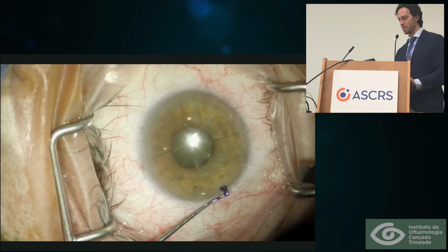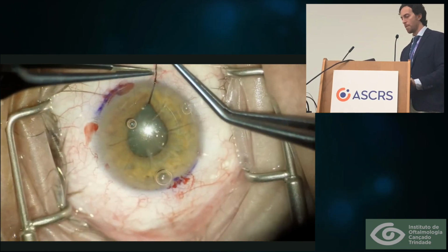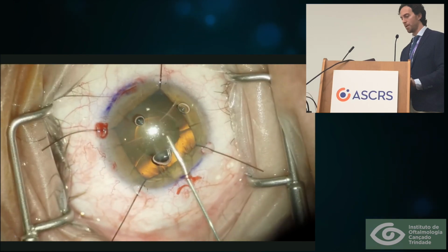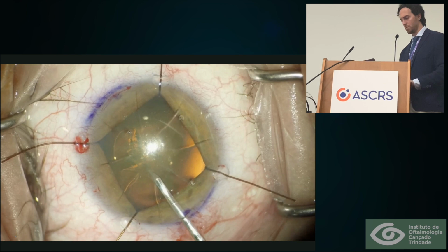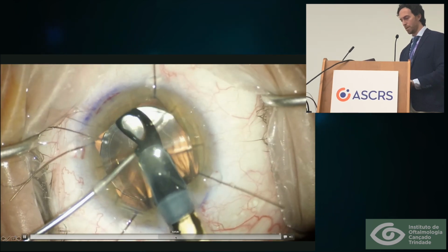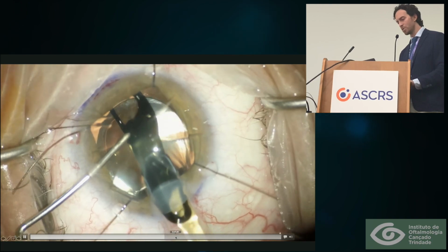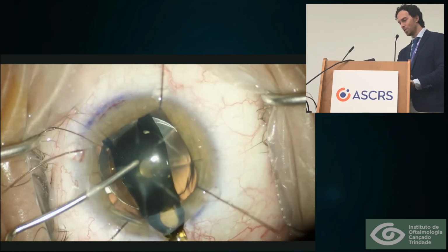And the surgery was amazing. Nothing special. In this case, we did the limbal relaxing incision. Nothing special of the procedure, everything went perfect. This particular case, you will see now, it's fixed there.